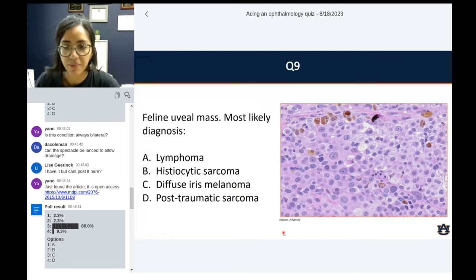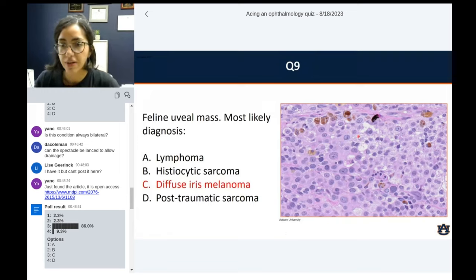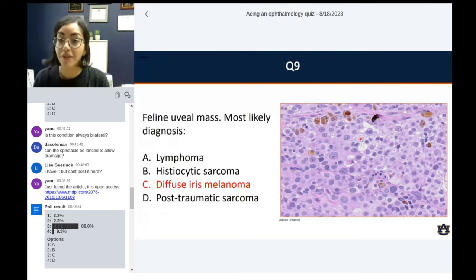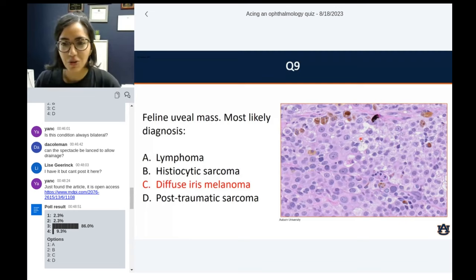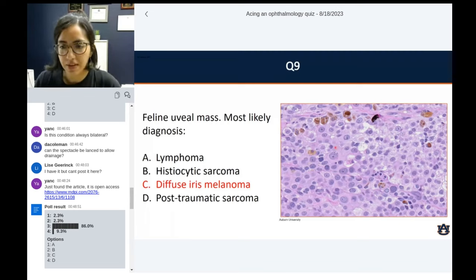Diffuse iris melanoma. The big thing here with this histopath — it gives you a location: it is a uveal mass. It's pretty anaplastic looking — this large gigantic cell. Pretty marked anisocariosis, really bad-looking cells. If you're not familiar with the condition, any anaplastic neoplasia is fair game.